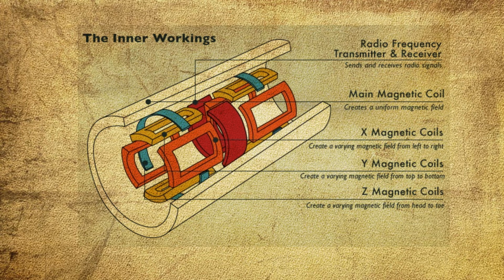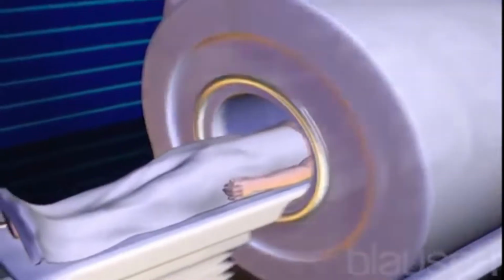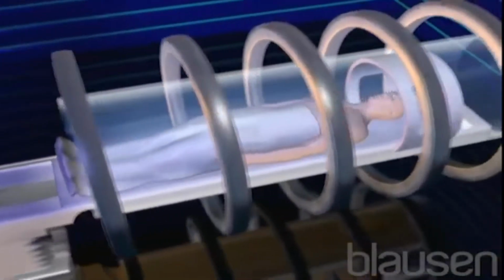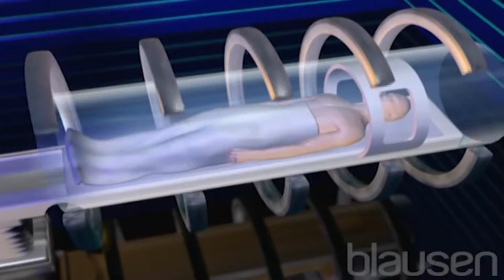Clinical magnets generally have a field strength in the range of 0.1 to 3.0 T, with research systems available up to 9.4 T for human use and 21 T for animal systems. In the United States, field strengths up to 4 T have been approved by the FDA for clinical use. There are different types of magnetic principles which are used, like permanent magnet, resistive electromagnet, and superconducting electromagnet.